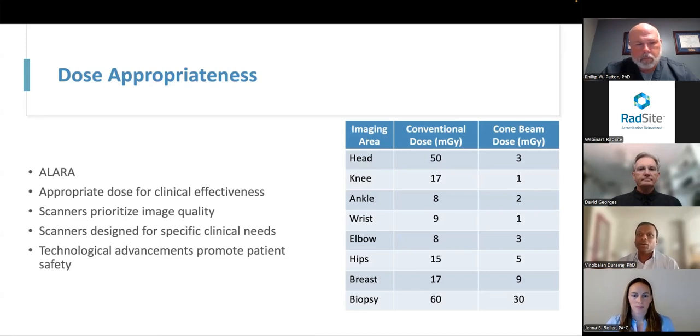Okay, so that's good to know. Everybody is talking about cutting down on doses for the betterment of the human population or the environment and stuff like that. It's good to know that you do have specific protocols for the bigger size patients also, because obviously we are scanning patients not for the sake of irradiating them, but to get some good images. So it's good that you have it. On that same note, David, in the CBCT world, do we have a difference in protocols, for example, dense breast versus small or large breast and stuff like that?